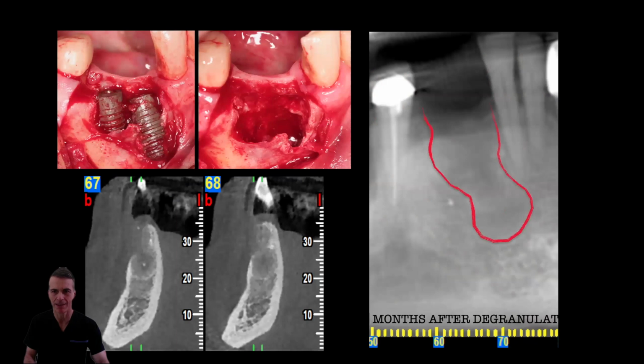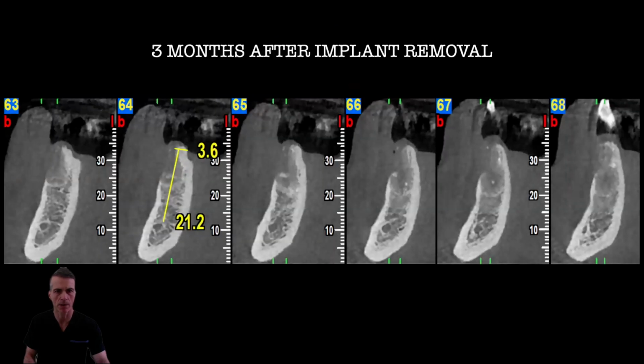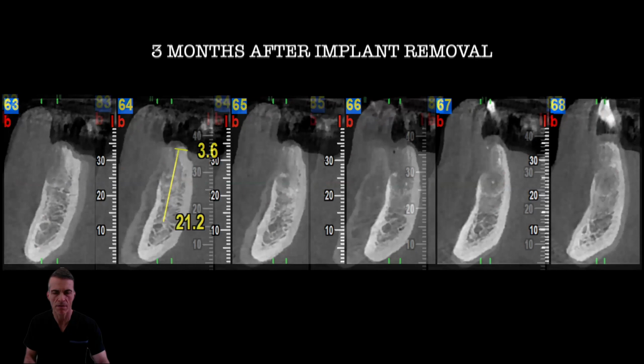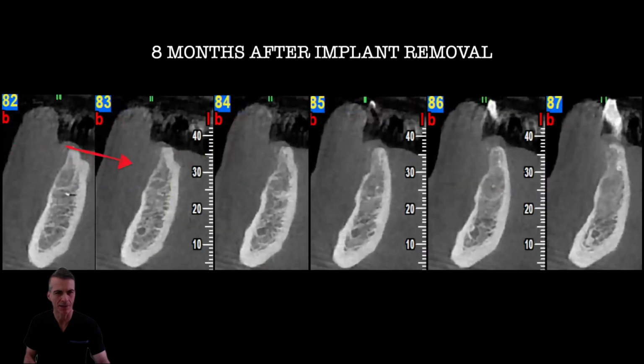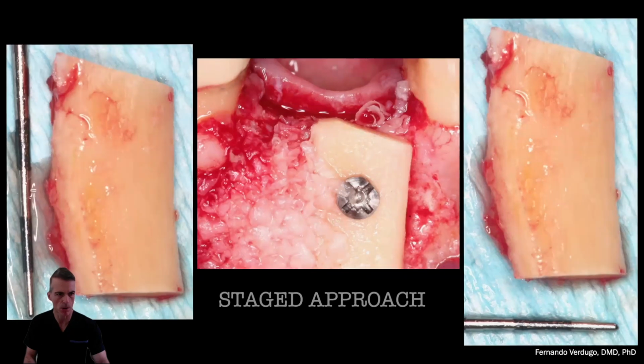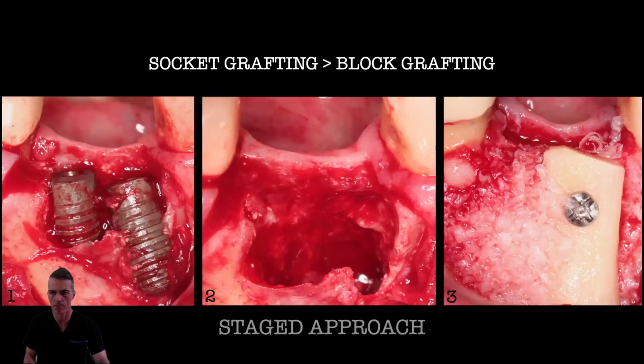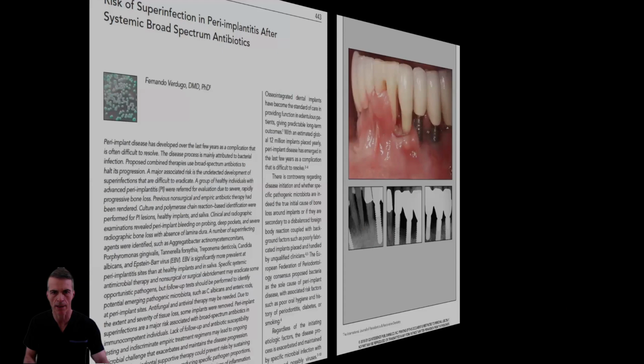You can see still that the defect has not healed properly. So I decided to wait after the first 3 months. I decided to wait an additional 5 months. And now we can start seeing some corticalization of that buccal aspect of the site so that we can do our augmentation procedure, which in this case was block grafting using a block from the ramus. These are different pictures from beginning to end.